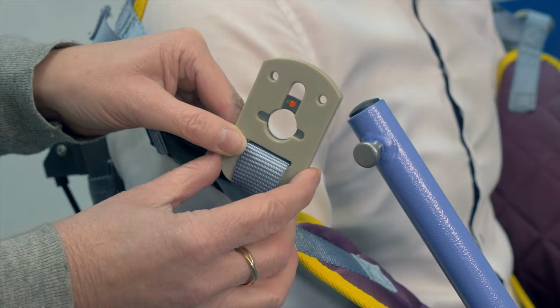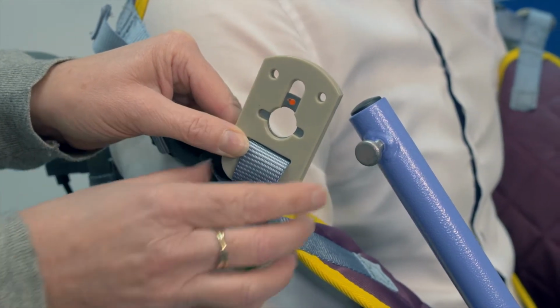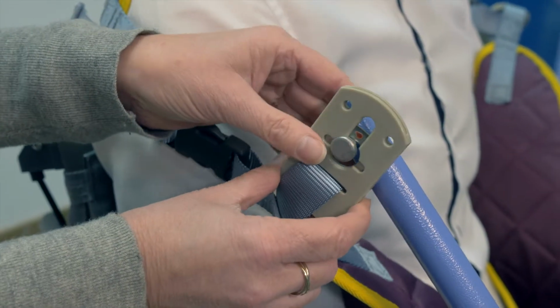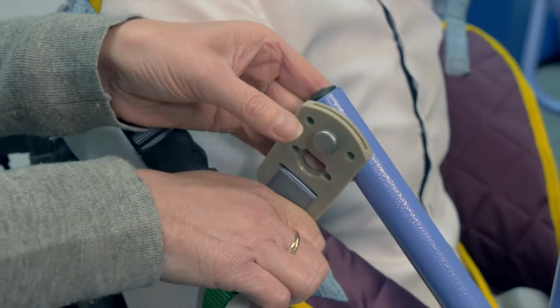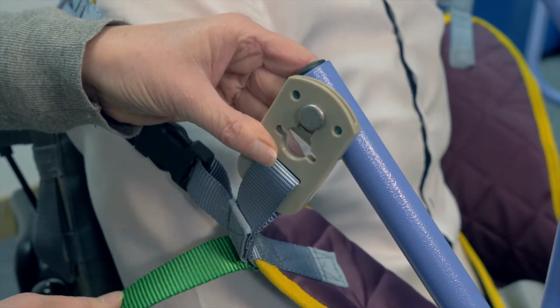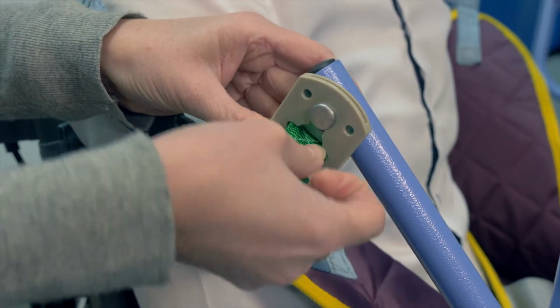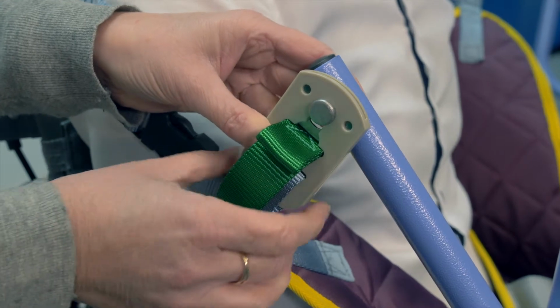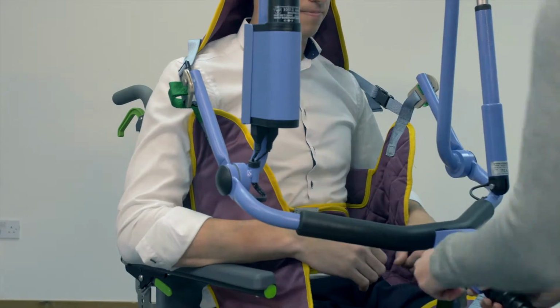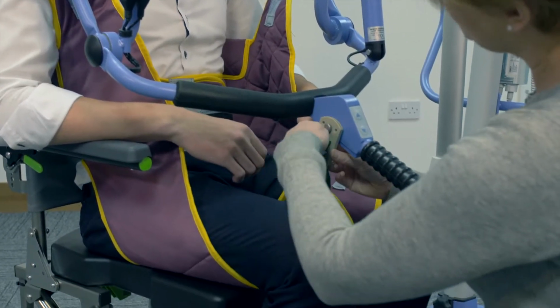To fit the sling to the hoist, you have to check that the red dot is showing to show that the clip is currently unlocked. Then you position it onto the hoist and pull down until the two green dots appear, and that shows that it's locked. As an additional security measure, you post the green webbing strap through the hole, and that means that the sling cannot detach itself. And the same for the leg channels.